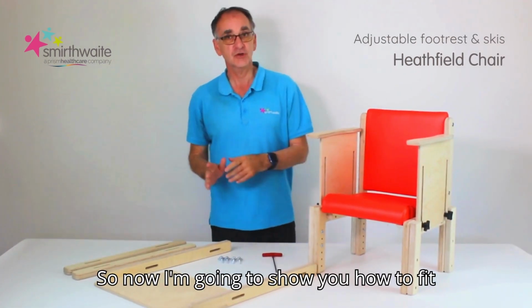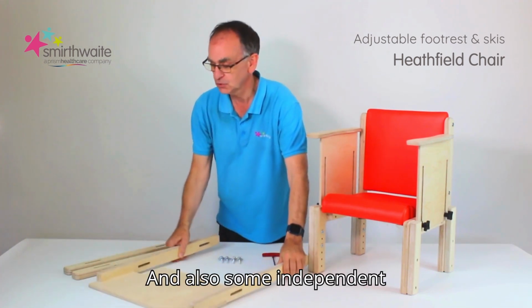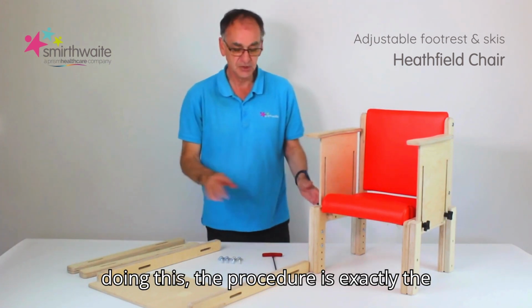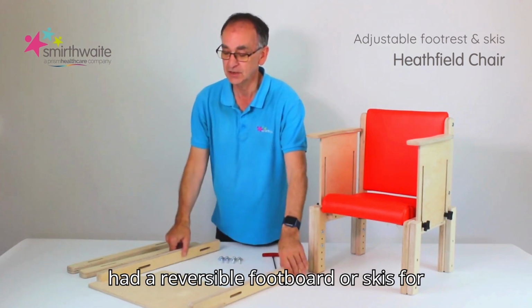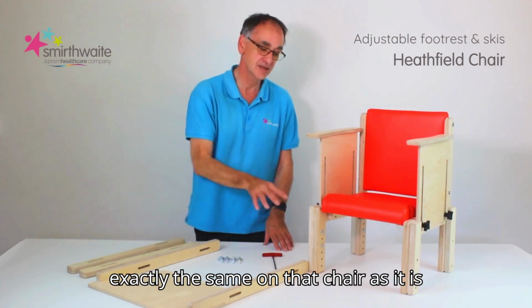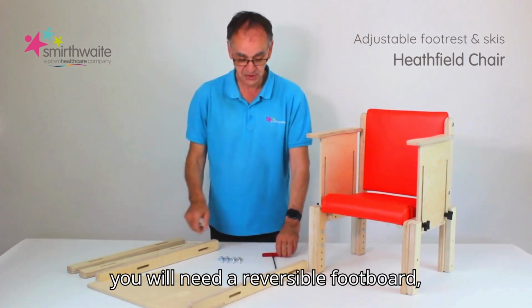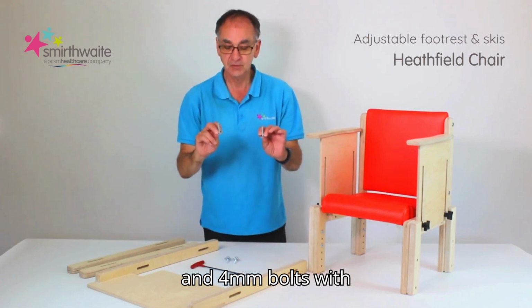So now I'm going to show you how to fit a reversible footboard and also some independent skis to the Heathfield. Just a point to note that whilst we're doing this, the procedure is exactly the same for the Brookfield chair. So if you had a reversible footboard or skis for the Brookfield, the process would be exactly the same on that chair as it is on the Heathfield. So you will need a reversible footboard, a 4mm Allen key and 4mm bolts with washers.